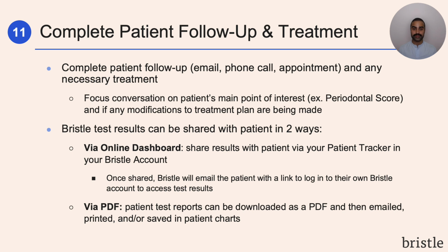After reviewing results and treatment planning, the next step is to follow up with the patient. Again, this could be just sending them their Bristle test results. It could be a call, an email, or a discussion at their next appointment. We encourage you to focus the conversation on what matters most to the patient and any changes to treatment or steps they need to take to address those concerns.